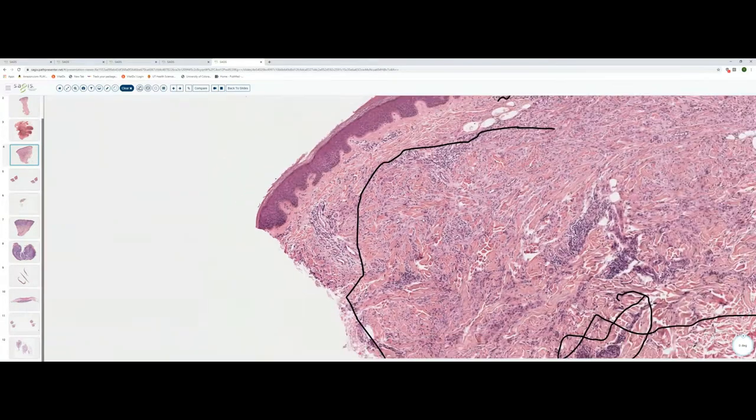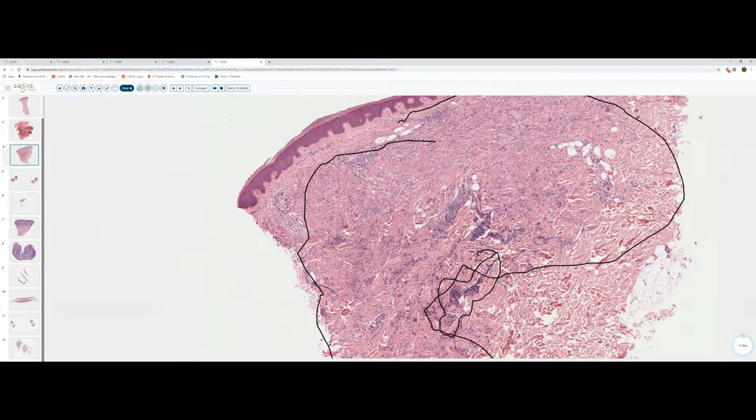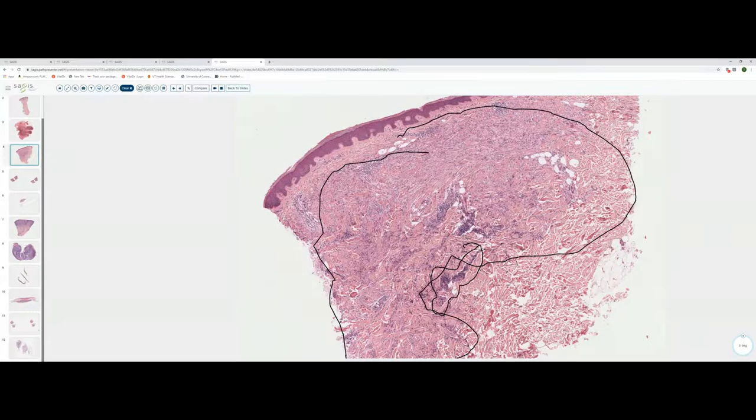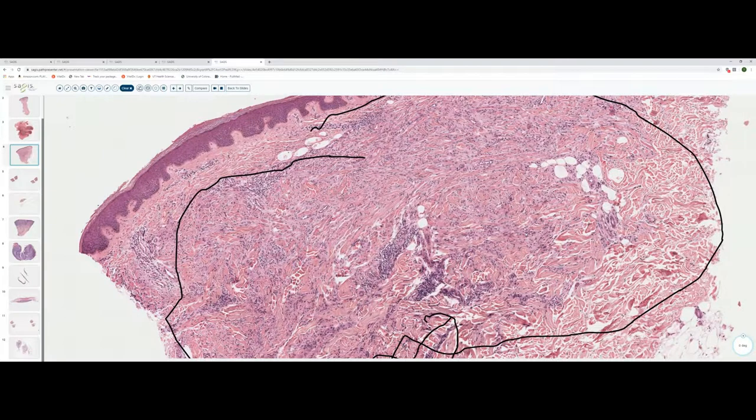Granuloma annulare can occur in a couple of different forms. Actually, you can get subcutaneous GA, but typical GA when it involves the dermis can give you either a distinctive palisade, where the histiocytes are arranged around collagen bundles that are separated from one another by mucin, or you can get an interstitial variant where you just get the histiocytes positioned between collagen bundles without a true palisade. A lot of times you'll get a mixed picture, and in a given biopsy you might see a bit of the palisade and in another area the histiocytes located interstitially between collagen bundles.